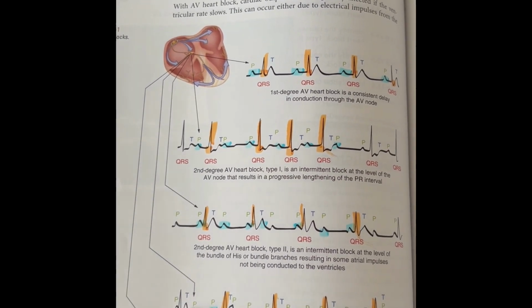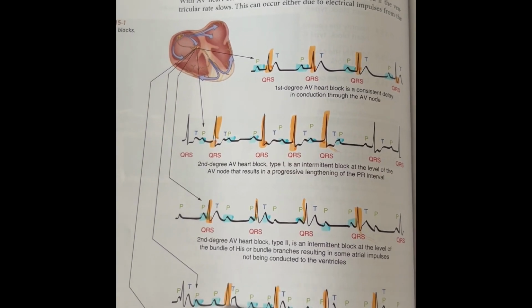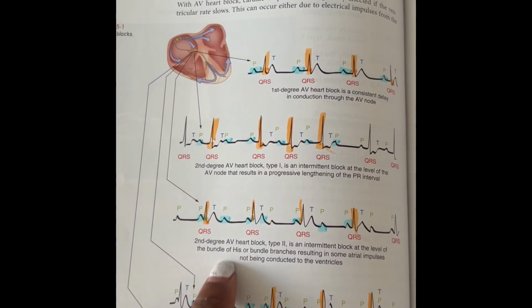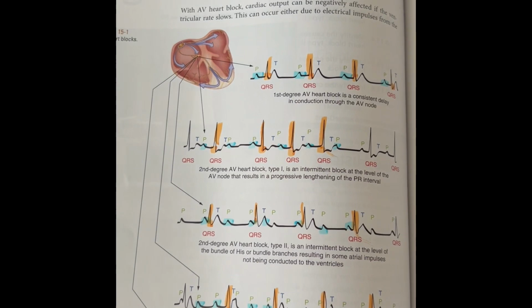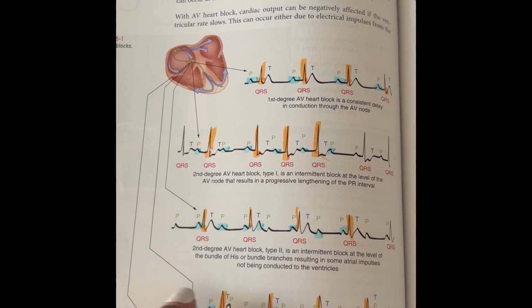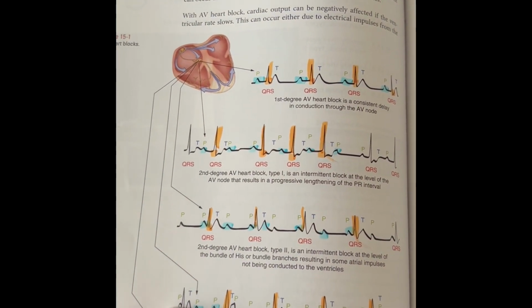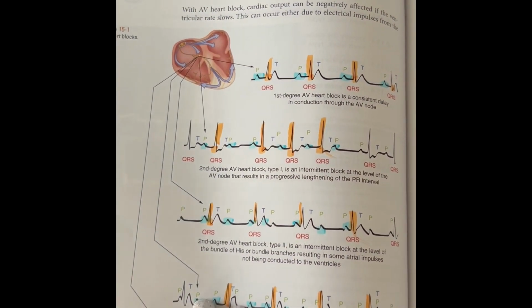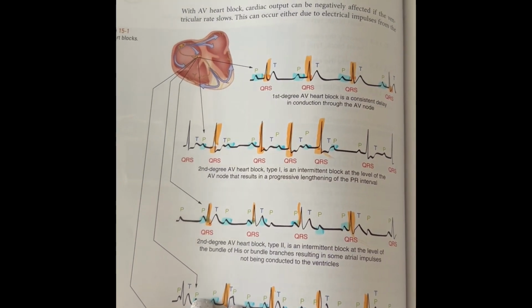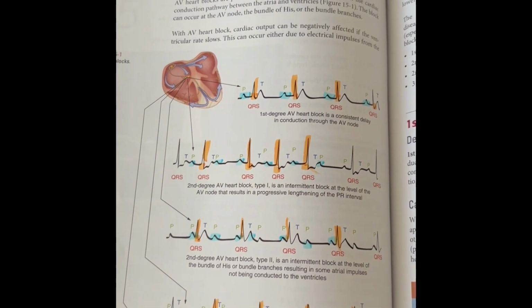She's doing her own thing. It's consistent. Sometimes it gets in his way. That's why you'll see some that come kind of off inside the ventricular rate, right? The ventricular rhythm. He's doing his own thing. They're equally constant doing their own thing. She's equally constant doing her own thing. There's one hit in there that you don't see, but she's doing her own thing. It bothers him, but consistent.